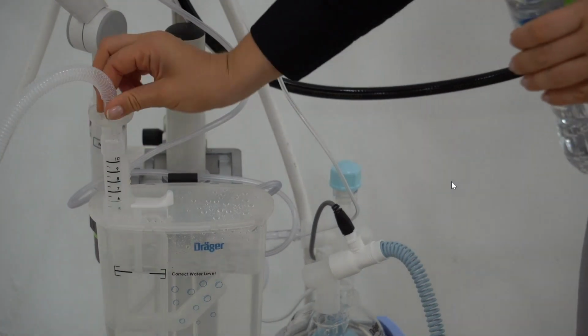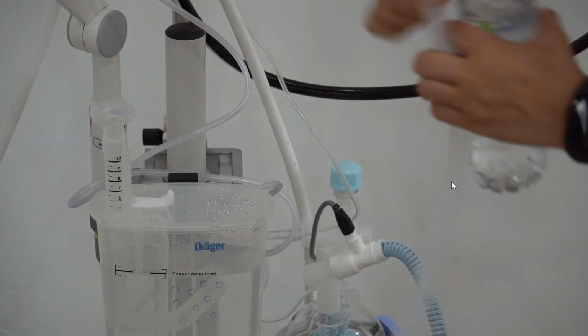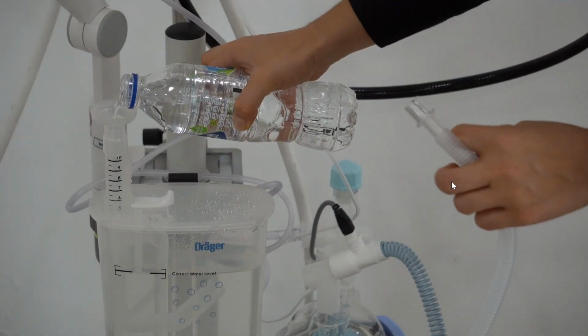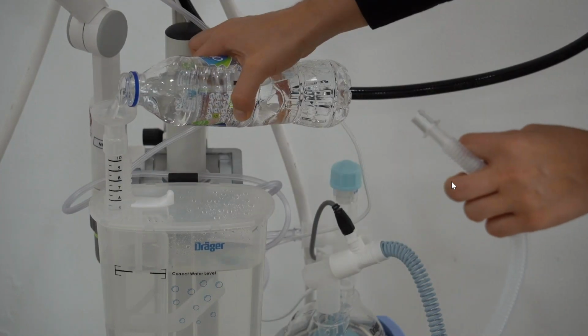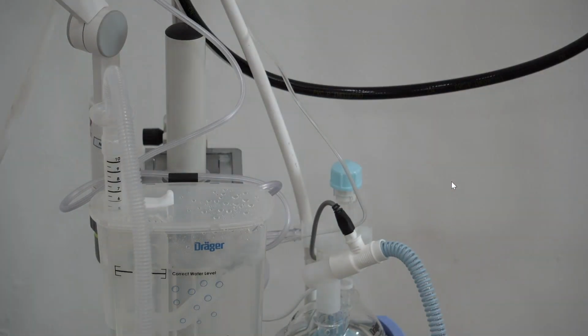So what you do, you just remove the expiratory limb and you add the water through the top tube. Yeah, so it's quite simple. I don't add too much, because then we would exceed the desired limit, but it's actually quite simple to add the water.